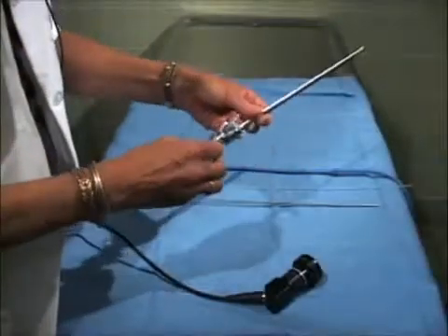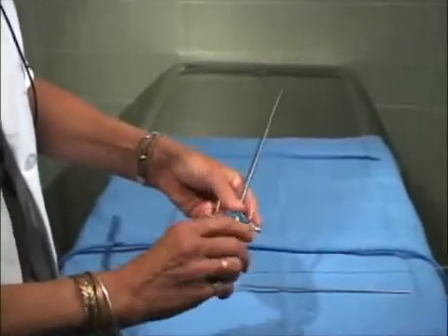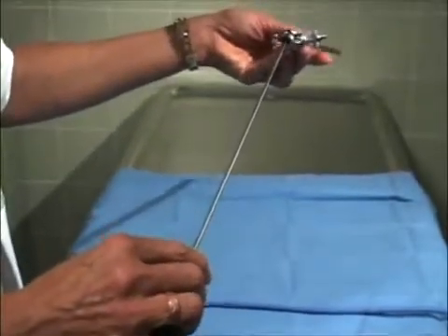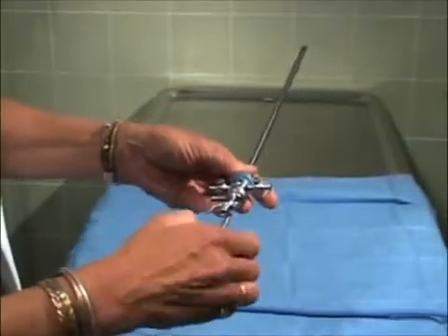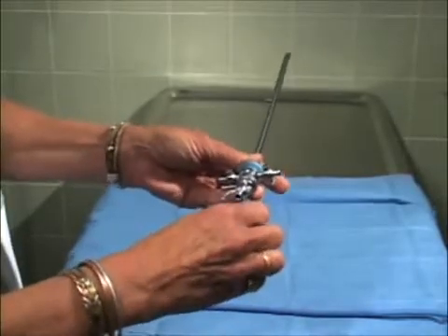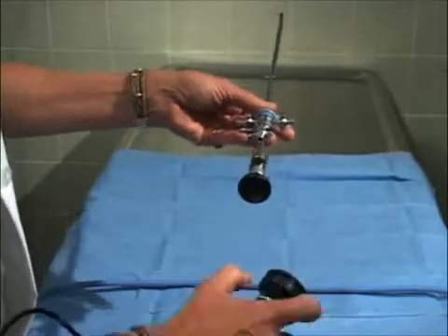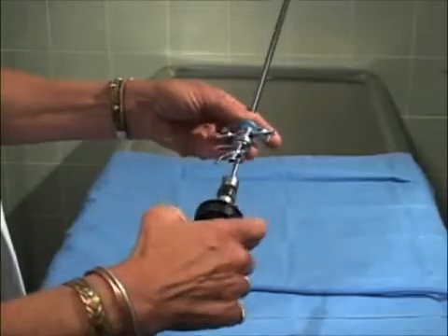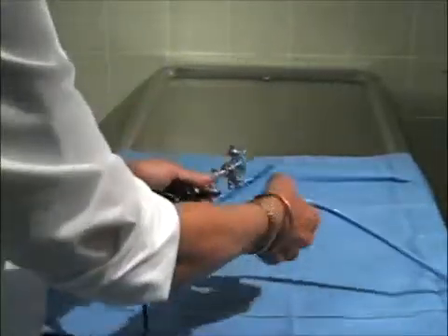We'll first put the bridge into the sheath. Then we'll put the telescope into the sheath. Attach the camera and the light cable.